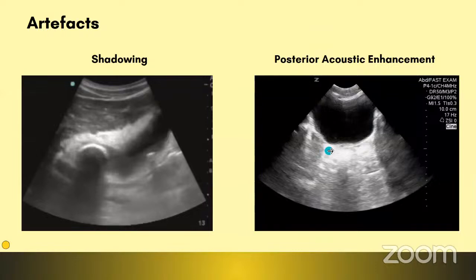So it makes the field much whiter. The term used here is hyperechoic, which I will discuss later. For now, for simple explanation, it becomes brighter because there's a higher difference in acoustic impedance between the fluid and the semisolids. This is called posterior acoustic enhancement.